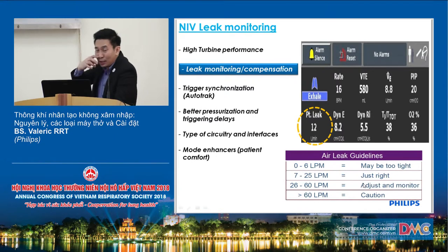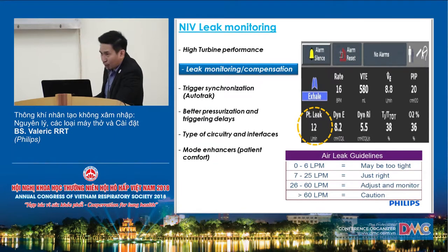But for me as an RT, I always put it at 15 to 20, so it's very comfortable to the patient, and it's not causing any sores to the patient's face as well. 15 to 20 is the best figure for intentional leaks.